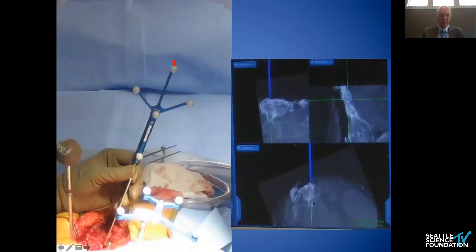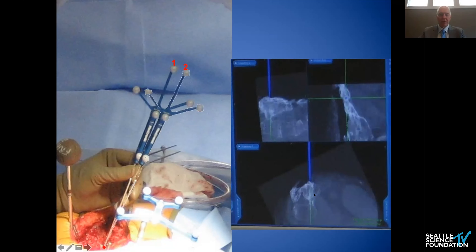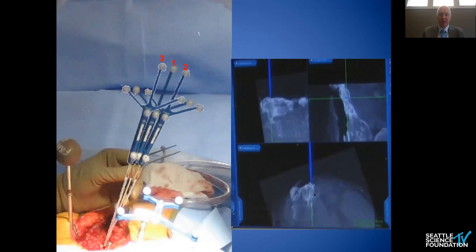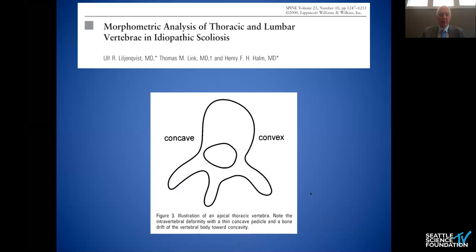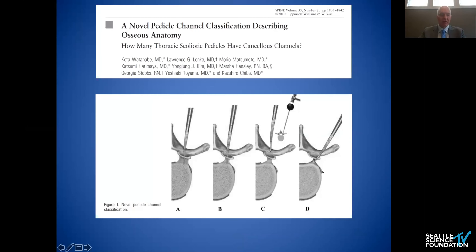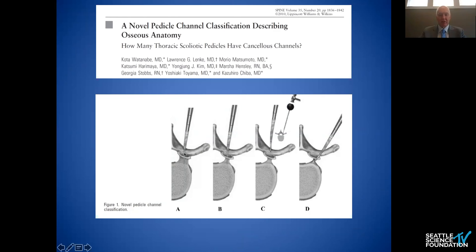This is a revision of a previous fusion requiring a pedicle screw at L1 through a fusion mass. This trajectory is perfectly positioned; this one puts the screw out medial; this one puts it out lateral. How good are you freehand with that little tolerance for error? Scoliotic pedicles — the concave pedicle is much smaller and higher risk because the cord sits right there. There's a classification scheme, and we seem to reliably place screws even in type C and D pedicles. Navigation may not be necessary for type A pedicles, but for type D, things are different.